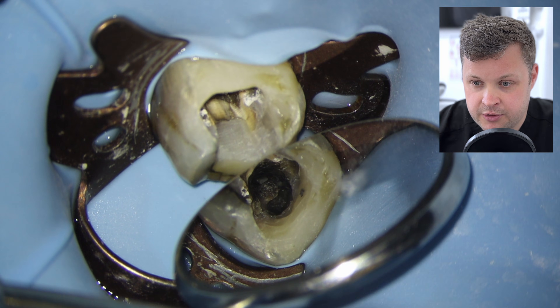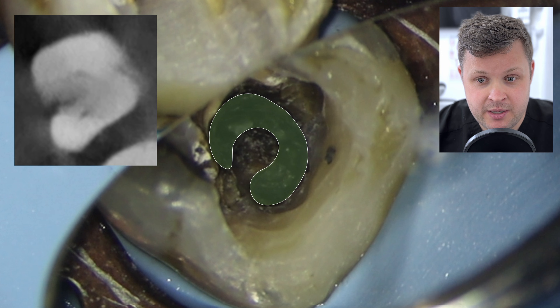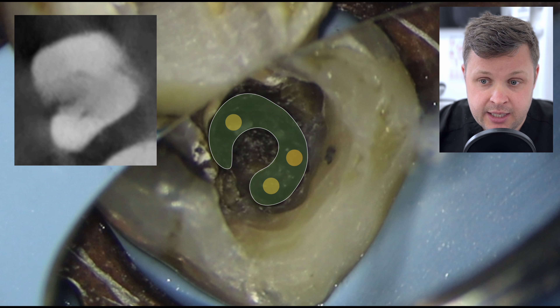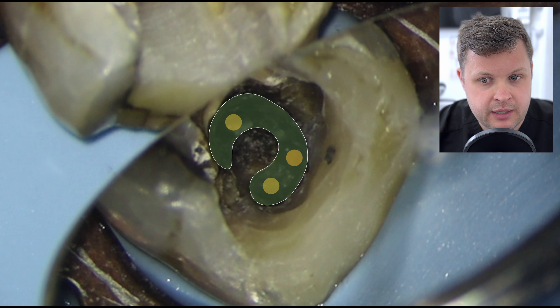Once we've opened up the cavity, we can see there is an obvious c-shape which corresponds with the CBCT scan. Using the CBCT, we're looking for three orifices. On the CBCT you can only obviously see a distal canal and what I'm calling a mesial canal, but there are no obvious two separate spaces. The problem with CBCTs is that sometimes the resolution doesn't show anatomy that is actually present — that's a really important thing to consider. CBCT is not the panacea or be-all and end-all of imaging.